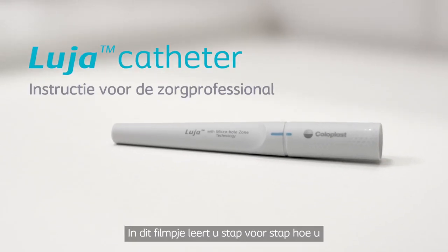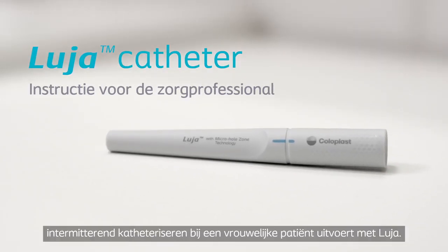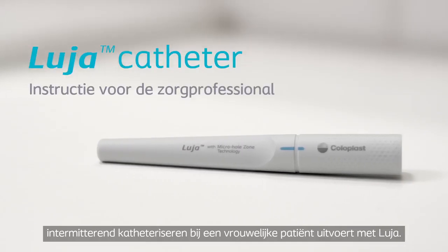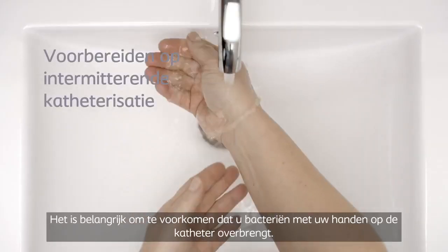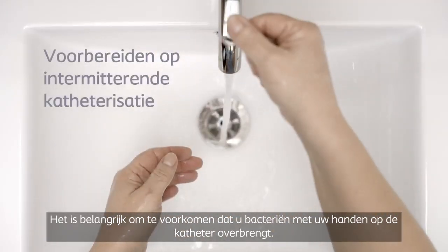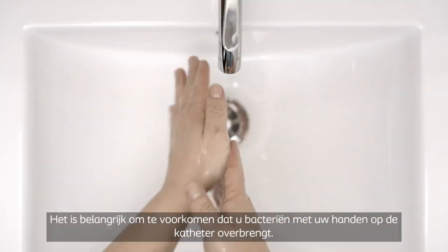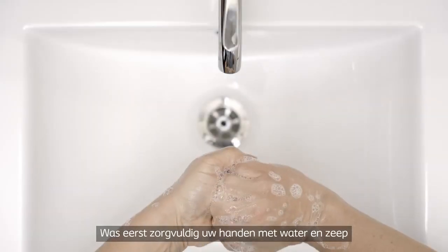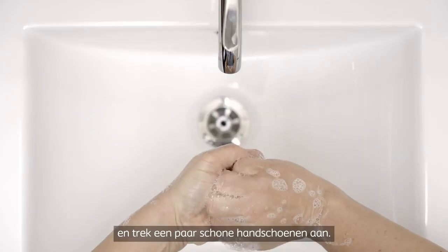In this film, you'll learn step-by-step how to perform intermittent catheterization on a female user with the Luja catheter. It's important to avoid transferring bacteria from your hands to the catheter, so start by washing your hands thoroughly with soap and water and apply a pair of clean gloves.